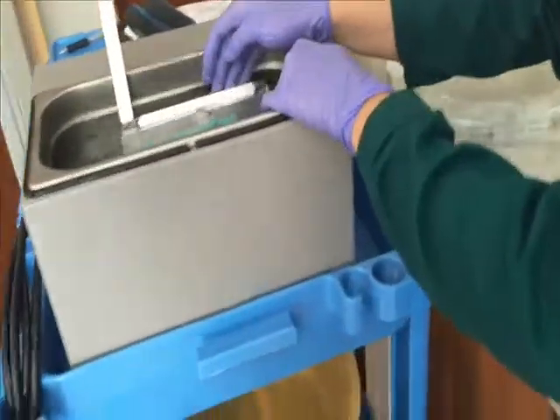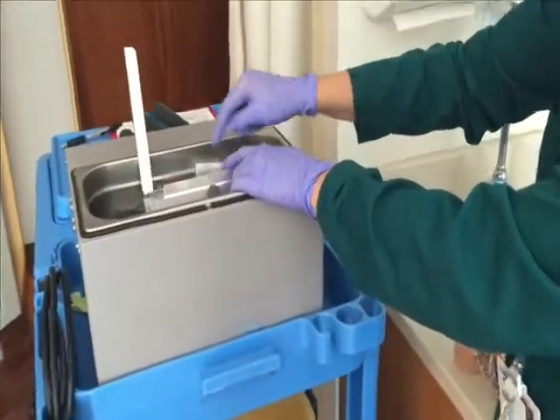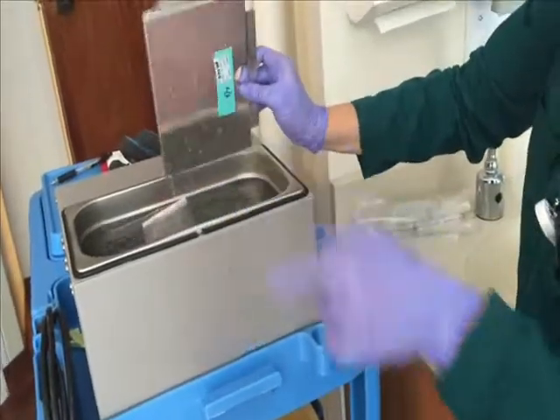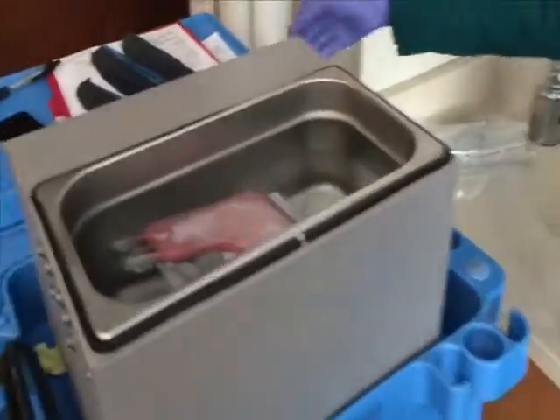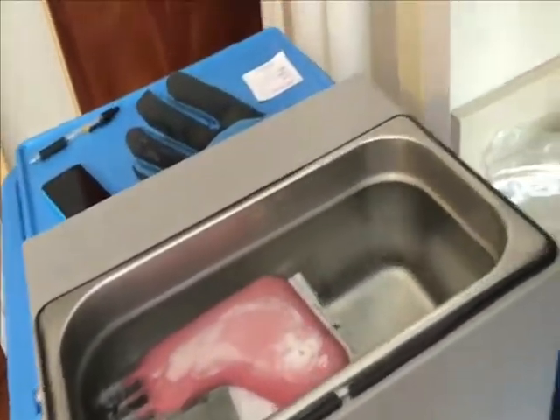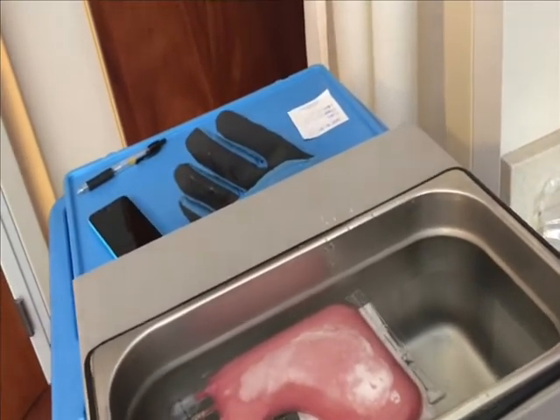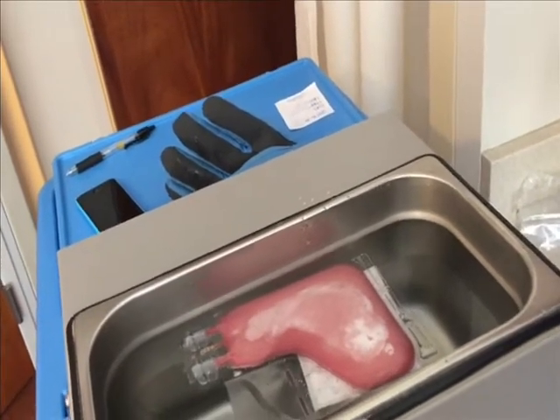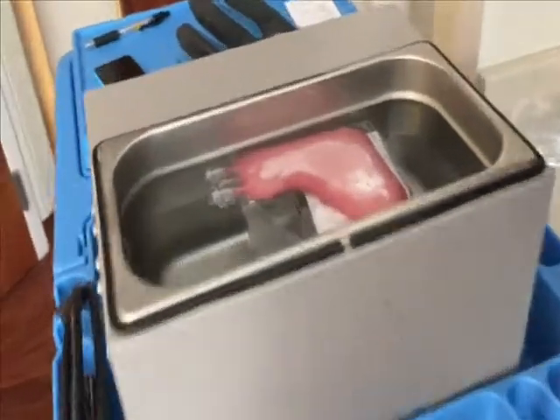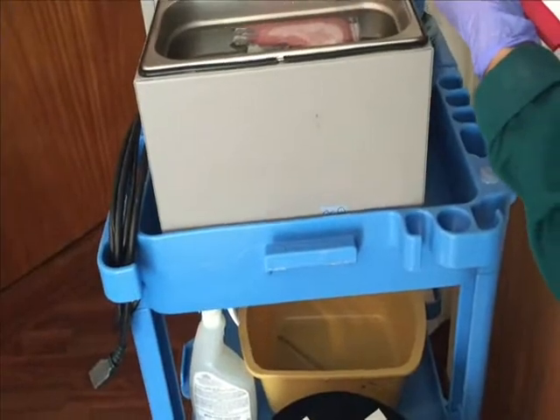So you've got three pouches of them. Yeah, from that specific collection. And we're giving her 2 of them today. And then the third one, I take it, is probably smaller. I think it's the same size. Let's see. Just 2. Oh, you're right, it's 37 milliliters. We put the first 2 bags in at 4 million, and the last one is 1.97 million. All right.